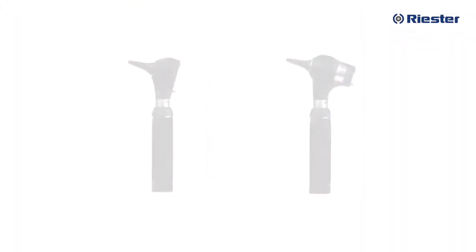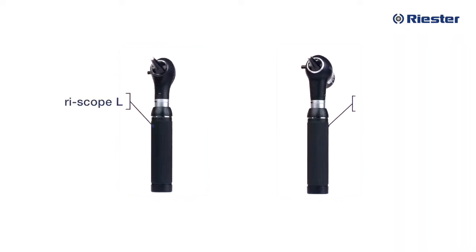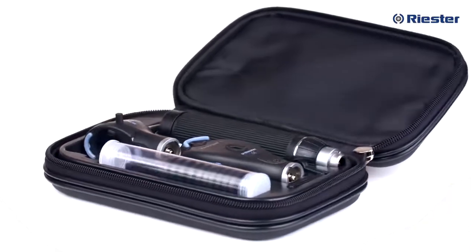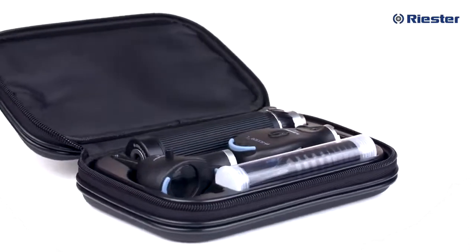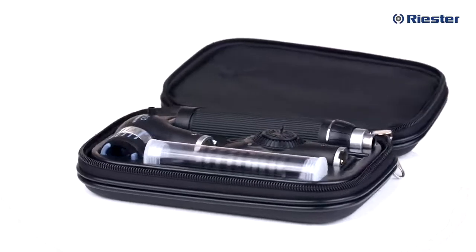Now let's take a closer look at the Riester EENT diagnostic sets, namely RiScope L and EliteVue. There are options within the Riester EENT professional diagnostic line and the two most popular are the RiScope L3 fiber optic otoscope coaxial L2 ophthalmoscope set, and the EliteVue macro otoscope coaxial L2 ophthalmoscope set.